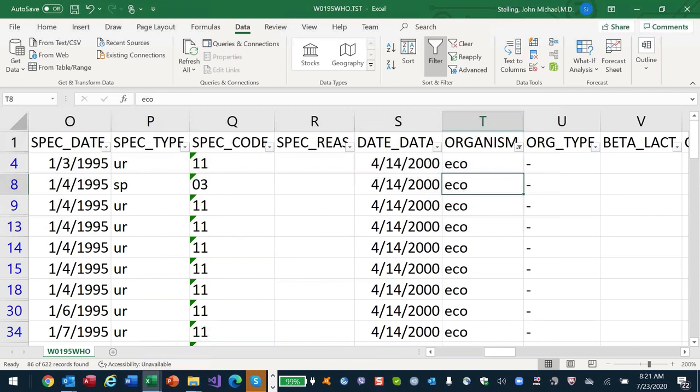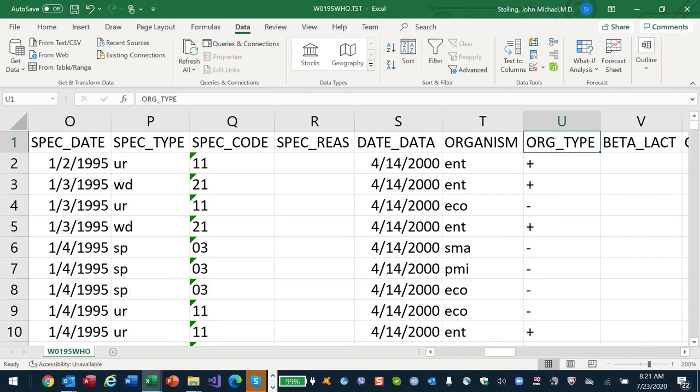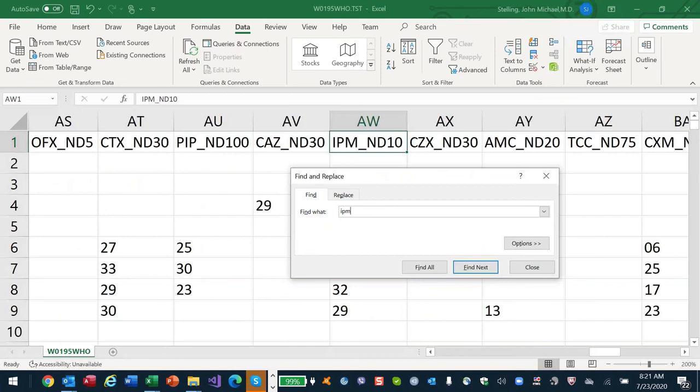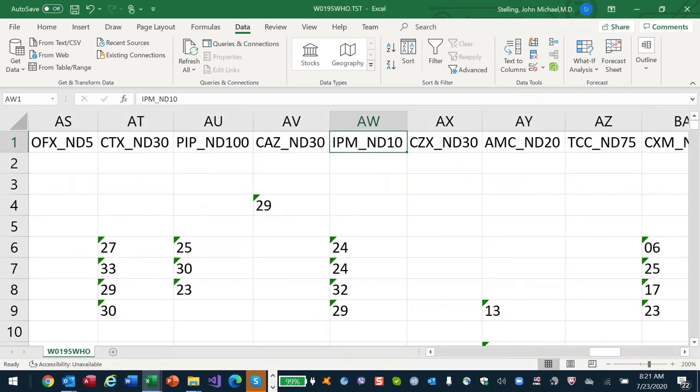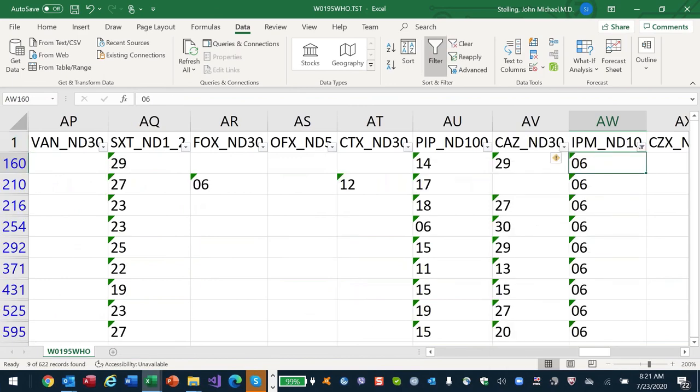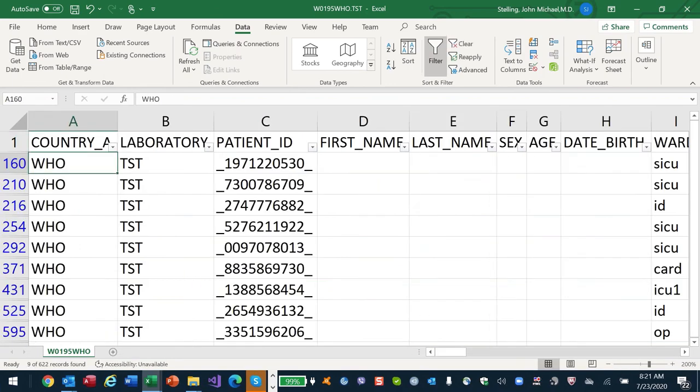If I just wanted to find the CRE, I can just go to the imipenem column, and I just look for the small zone diameters, like 6 millimeters is complete resistance. So Excel is valuable if you know Excel from doing a lot of these simple manipulations. We cannot edit the data in Excel. Excel will not do that with a DBase or SQLite file, but Excel is very valuable for visualizing your data.